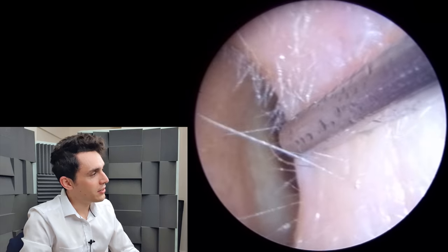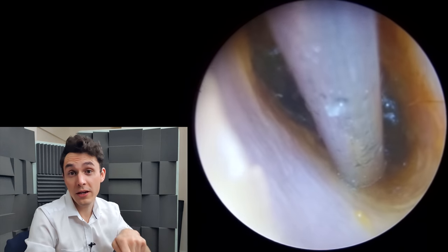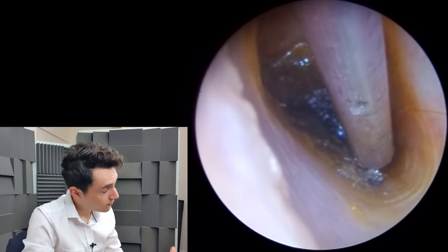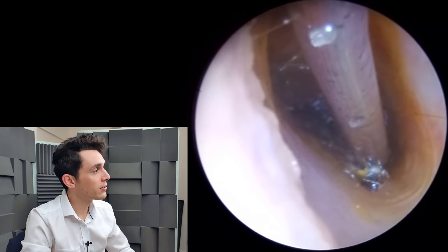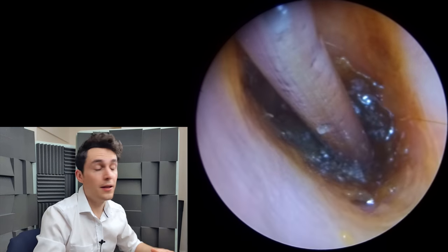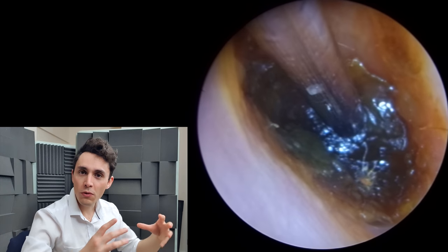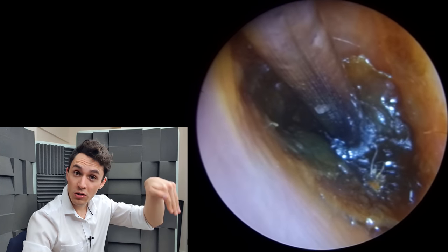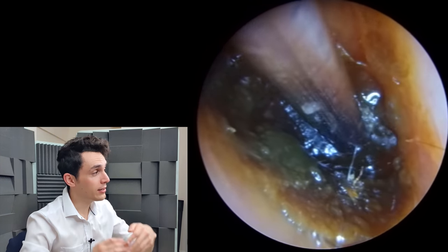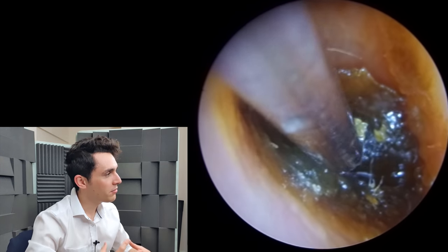The other reason it's a challenging case is because I think the patient pushed the wax further down, and at some point he used some softening drops to soften or dissolve the earwax. It softened and liquefied a little bit, and then he gave up. The liquefied debris crept into all the little recesses and gaps — you have a trench just in front of the eardrum: the inferior recess and anterior recess. So the wax crept into those recesses and then solidified again, having plenty of time to firm up and harden.